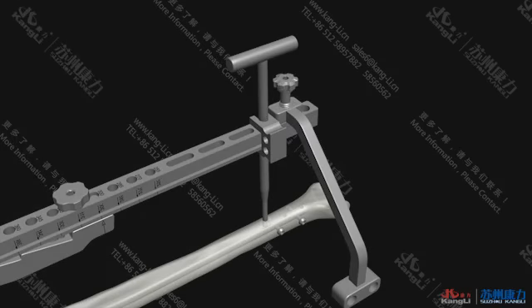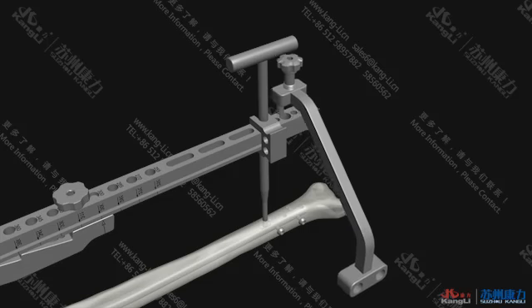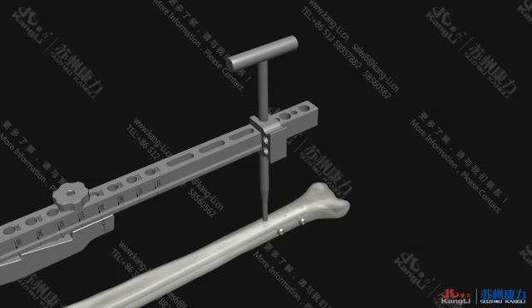The third and fourth 4.5 locking screws could be placed at the front or rear of the nail of KTO tibial intramedullary nailing system according to the requirements by the type of the fracture. The operation should be performed as the following.